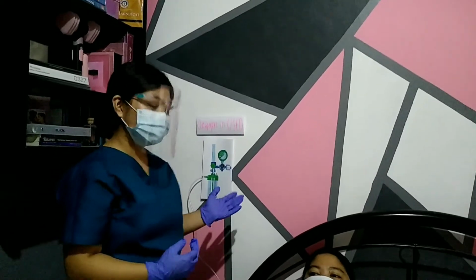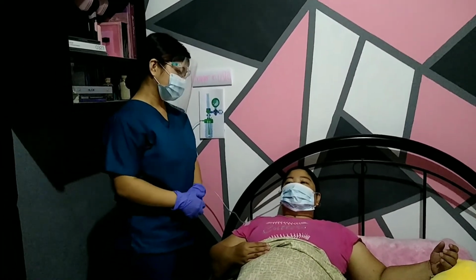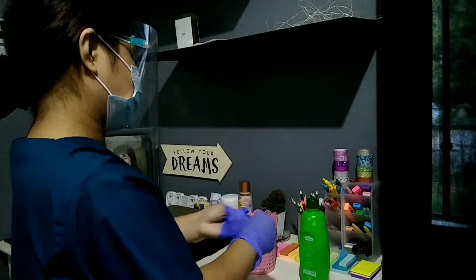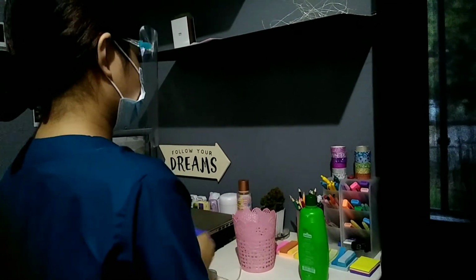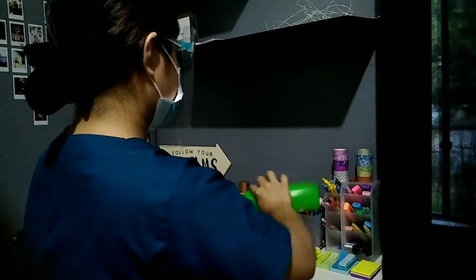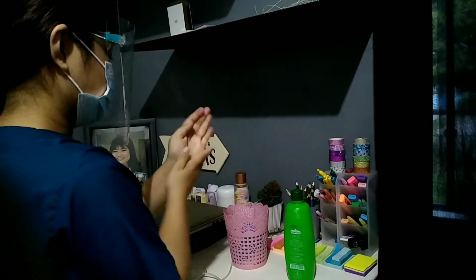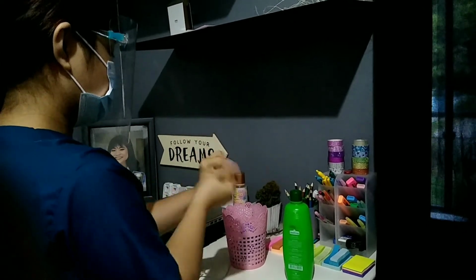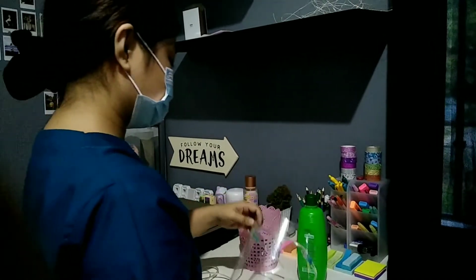And then that's it. You can now ask your patient for permission to leave. Okay, ma'am, may I go out first for a while? Okay, thank you, ma'am. And then, after it, you can now dispose of the gloves properly. Okay, and then do the proper hand hygiene. You can now remove also the face shield.